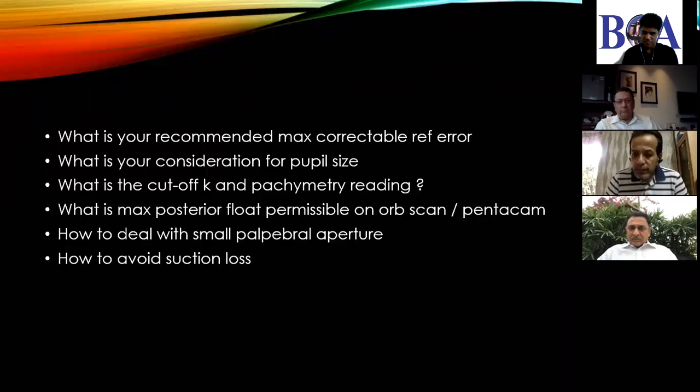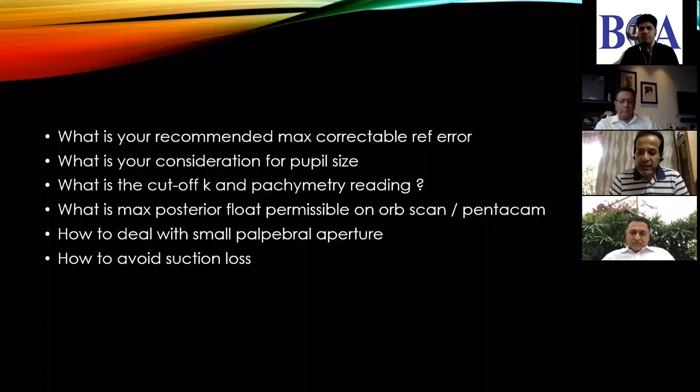Basically, you need to use a good, rigid speculum. Now, the problem which occurs in these cases is that when you try to open the speculum, the patient is uncomfortable. So what we do normally is, just before applying the ring with the microkeratome, I would open up the speculum a little bit more.